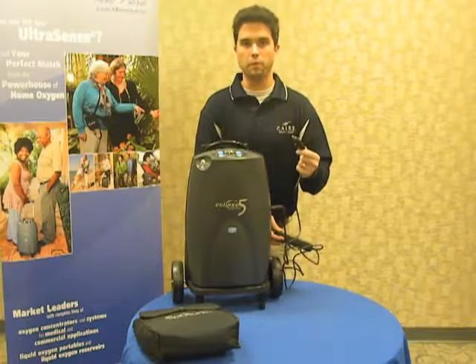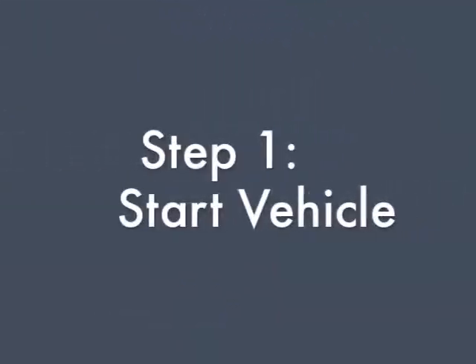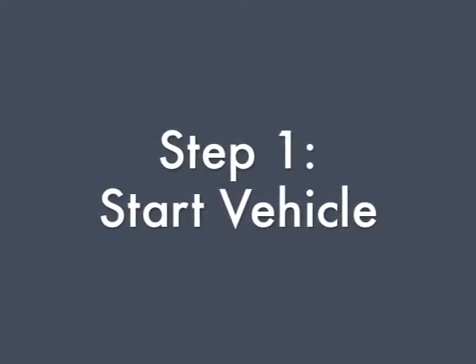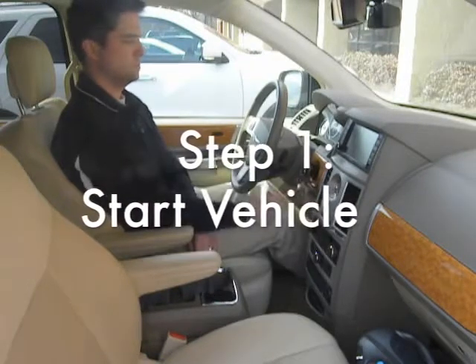Now let's explore how to use it properly in the car. It's very important that you crank your car or start your vehicle before plugging in the Eclipse 5 to the DC accessory outlet and let it run for just a minute. While the car's running for just a minute, you can go ahead and properly position your Eclipse.